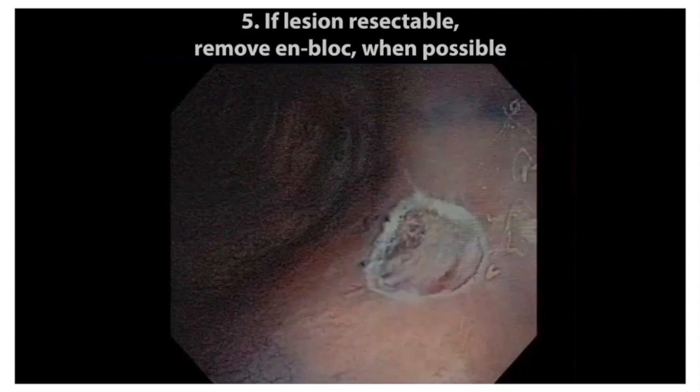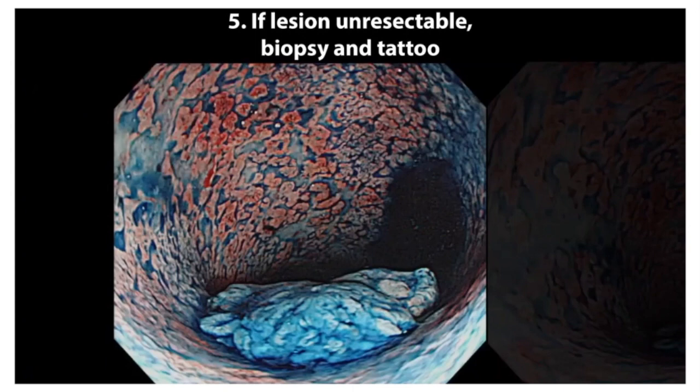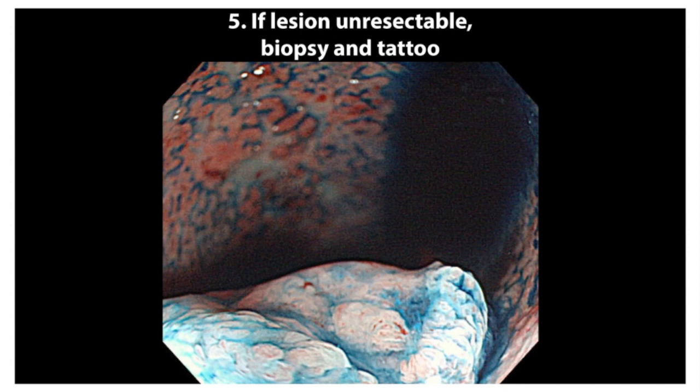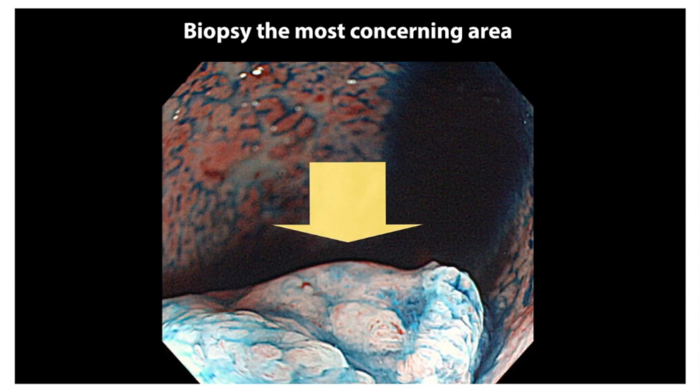In a patient with chronic colitis, a sessile lesion was identified with chromoendoscopy. Upon closer inspection, the lesion had features suspicious for invasive malignancy — the center was depressed and the surface amorphous with loss of mucosal detail. Decisions on endoscopic versus surgical resectability were deferred pending biopsy results. Biopsies should target the most concerning area; biopsies confirmed invasive cancer. Surgical resection demonstrated T1N0.